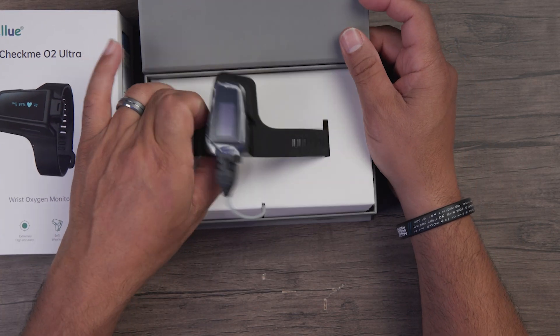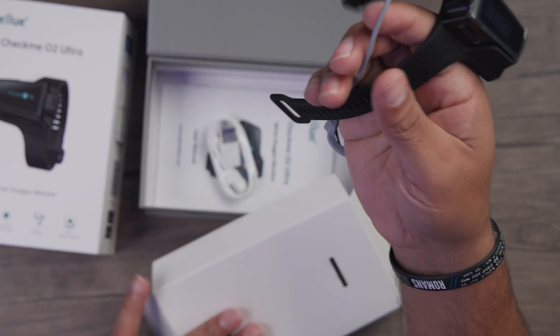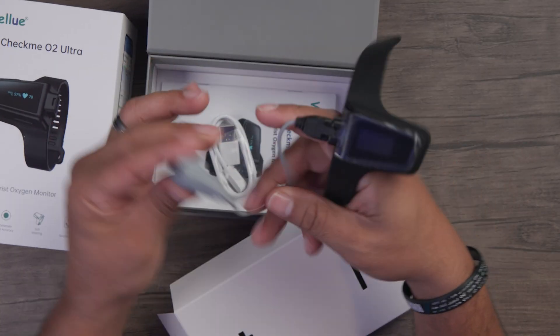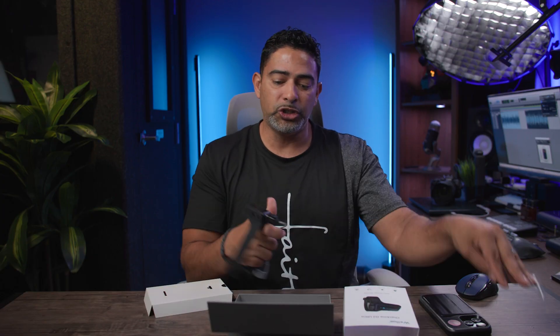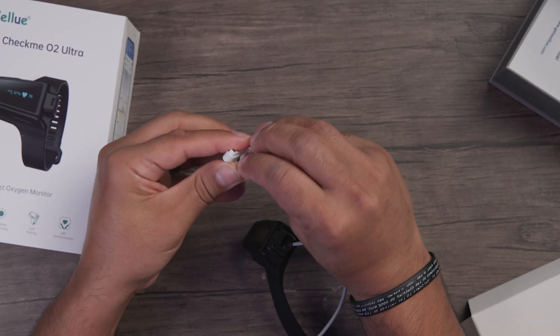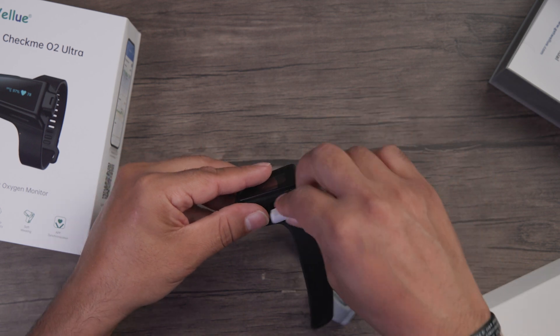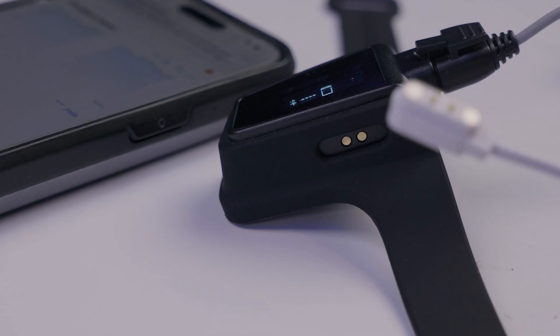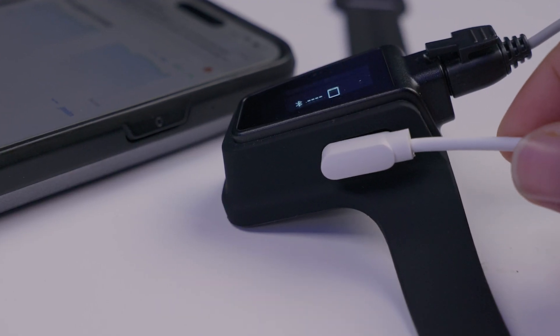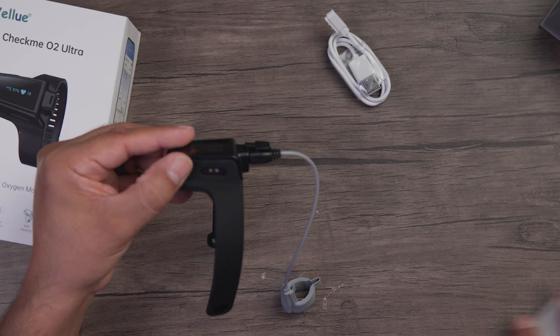Inside the box you'll have your oxygen monitor right here. You'll see this goes on your wrist, and this part will actually go on your finger. As far as charging, you definitely don't want to lose the charging cable. This does have a proprietary charging port, so you're not going to use a normal USB-C or USB charger — make sure you have this on hand. You'll also have your instructions included.